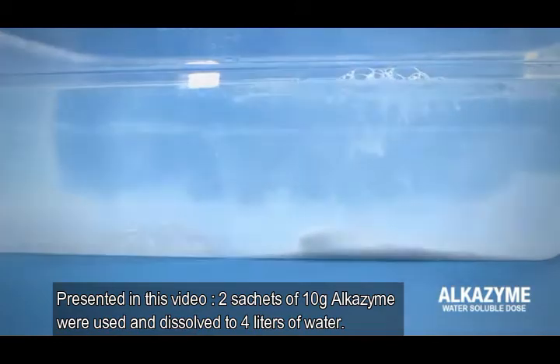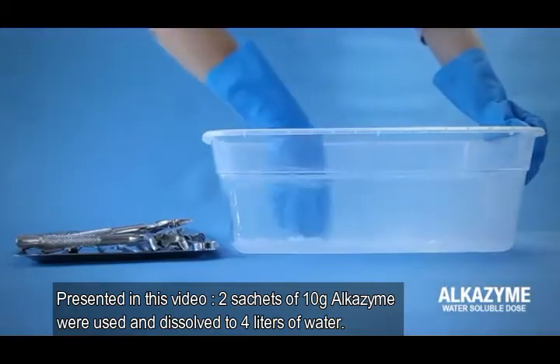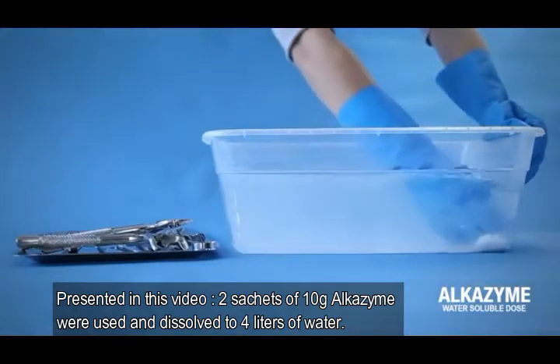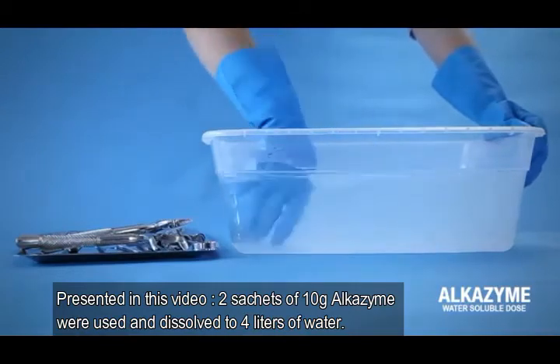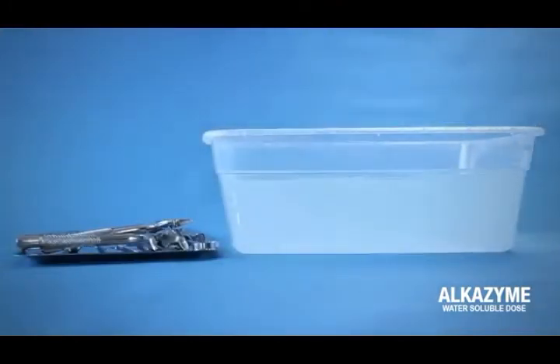Once dissolved, the detergent solution is mixed for 30 to 60 seconds. What we obtain as a result is a clear detergent solution.